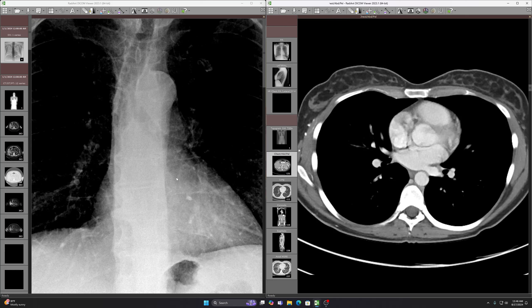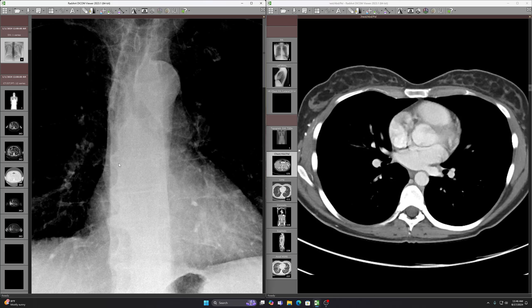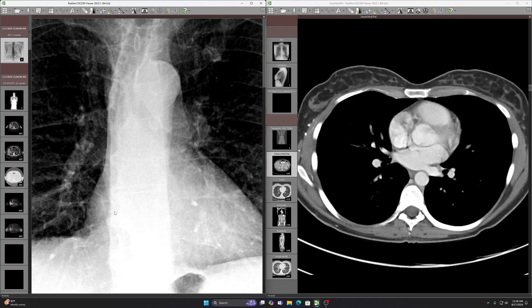One thing to note is how smooth the border of this abnormality is. That tells us it's likely not going to be in the lung, because masses or consolidation in the lung will tend to not have this smooth of a border. That's why I put that last in the differential.